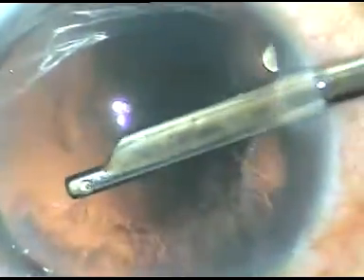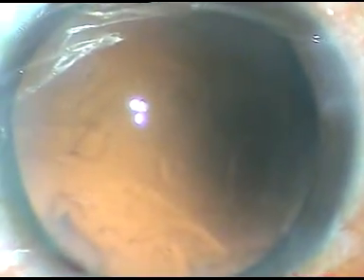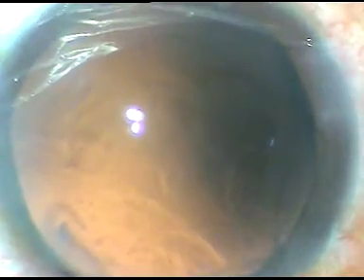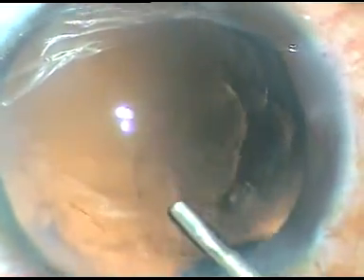I'm using my Simcoe cannula, 23 gauge direct Simcoe cannula, and removing the cortical matter. This instrument works faster than bimanual IA in my hands. So to save time, I use this instrument, very simple instrument. Now this is HPMC again.